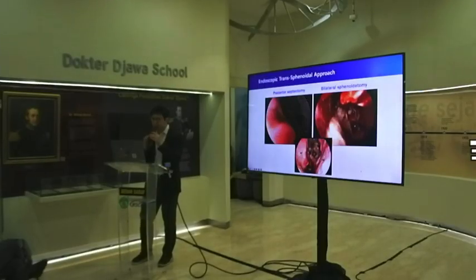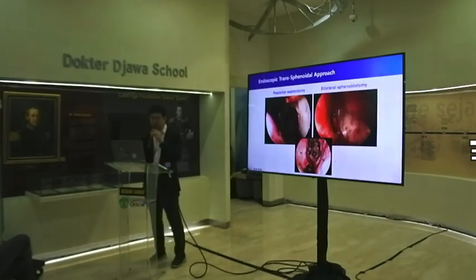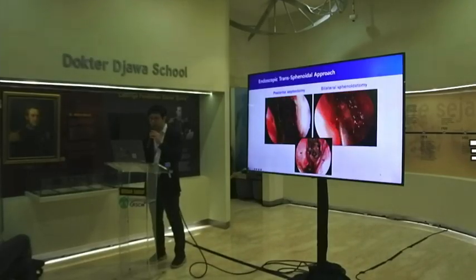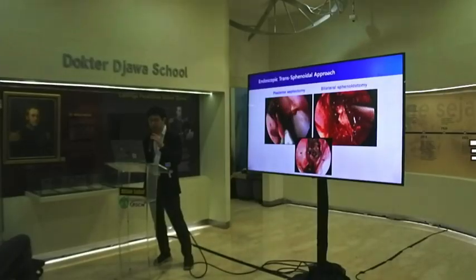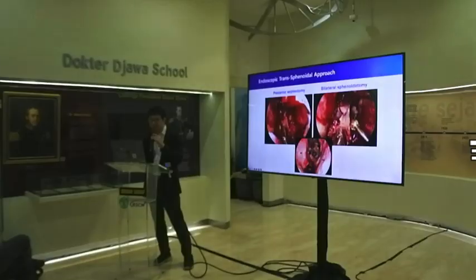These images show two key steps of the endoscopic transsphenoid approach. This is the posterior septectomy, and this is the bilateral sphenoidotomy. This allows for clear access to the sphenoid sinus. You can choose either as needed. By opening this, the final view is like this.